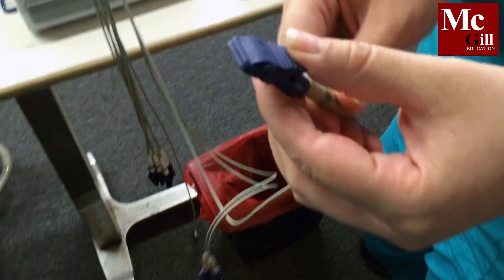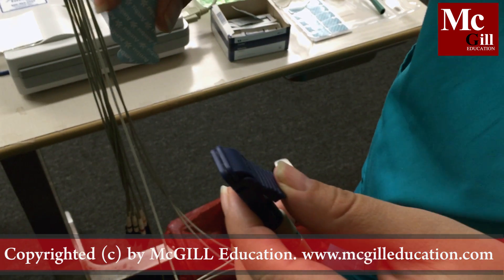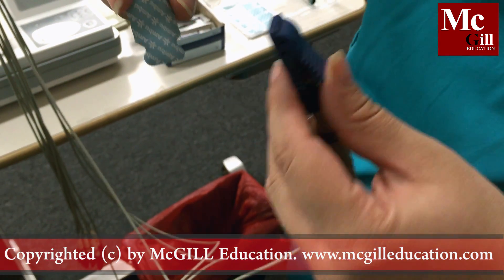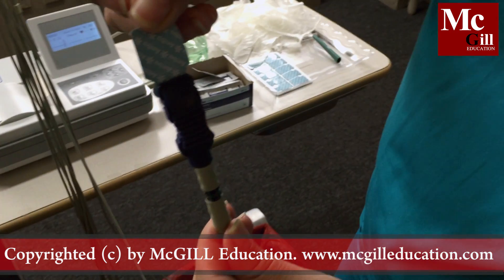Each cable ends with alligator clips. For demonstration purposes, this is your electrode — your electrode ends in a tail. The alligator clip must fully secure onto the tail of the electrode for a proper EKG.